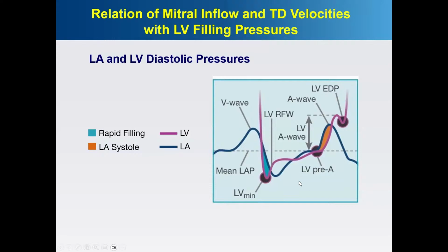After that transmitral pressure gradient has been established, we have another gradient in late diastole due to atrial contraction. The atrial contraction is measured by the A pressure rise, and a good contracting left atrium would have a high rise in the atrial pressure. Then the atrial pressure drops because the atrial muscle relaxes, so we have the X descent, whereas in early diastole we have the Y descent. The dotted line is the mean left atrial pressure, and please notice it is lower than both the A wave pressure and the V wave pressure.